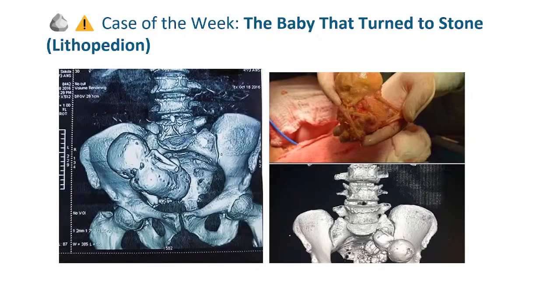In today's presentation, we will go through this remarkable case step by step. We will review the patient's clinical history, analyze the ultrasound findings in detail, compare them with X-ray, CT, and MRI appearances, discuss the differential diagnosis, explain how the diagnosis is made, and finish with learning points that every ultrasound professional should know.